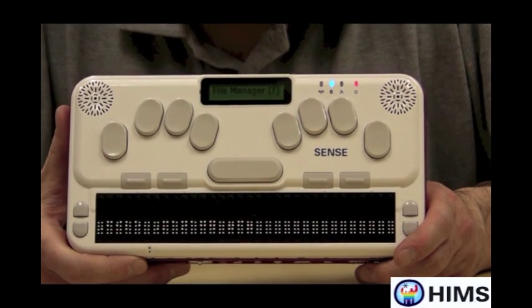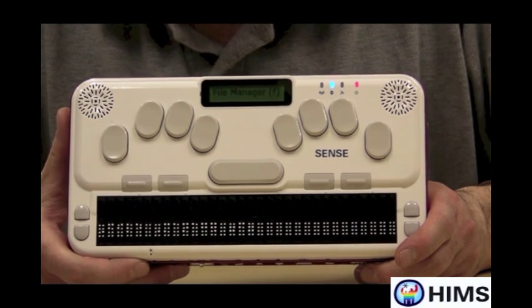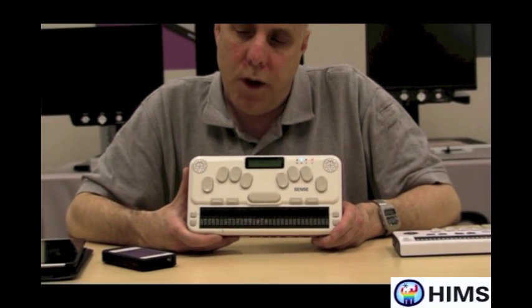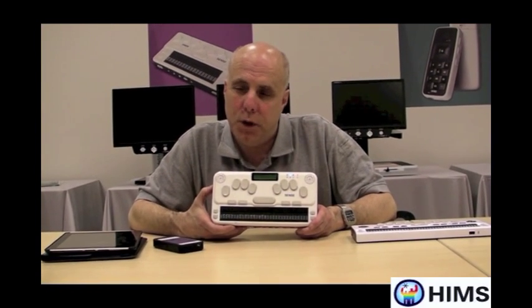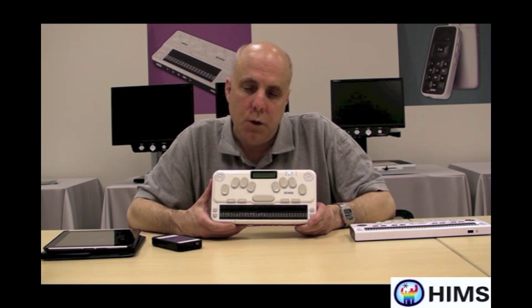But today we're going to talk about how the BrailleSense U2 can be used as a Braille display for the iPhone. As we all know, the iPhone and the iPad and the iPod Touch have really made their way into blind and low vision communities because people can use them — VoiceOver works — and now you can have Braille to go along with that VoiceOver work you're doing with your iPhone.